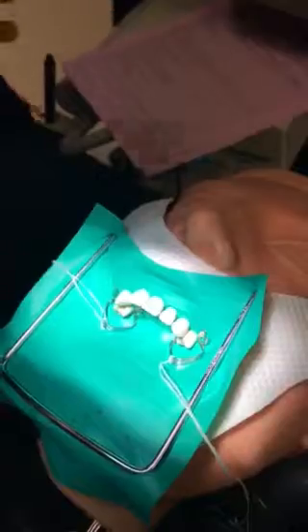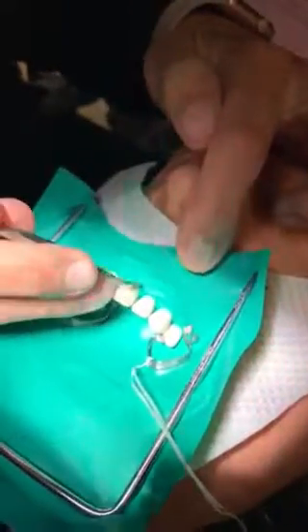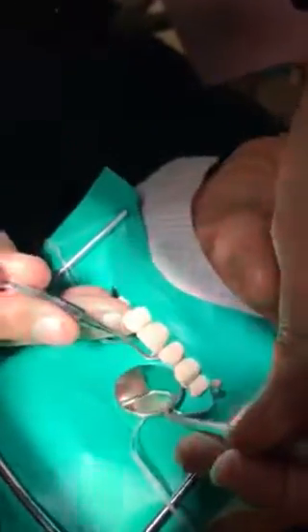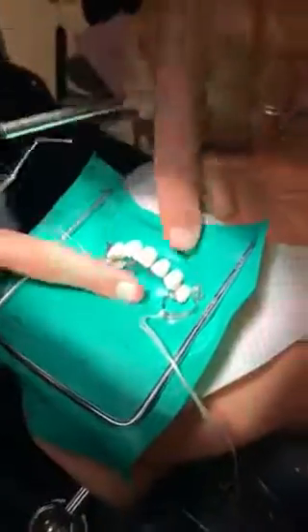Okay. So I floss my interproximals to get the dental dam down. Remember, I would dry, and then I would use my plastic filling instrument to make sure all my turtlenecks are down and around the teeth, which they are. And then I'm going to go in the lingual. Sometimes the lingual's up a little bit, so I make sure I push these down. And they're down. Okay, and then I'm going to check, make sure there's no holes, no tears, and we are perfect.